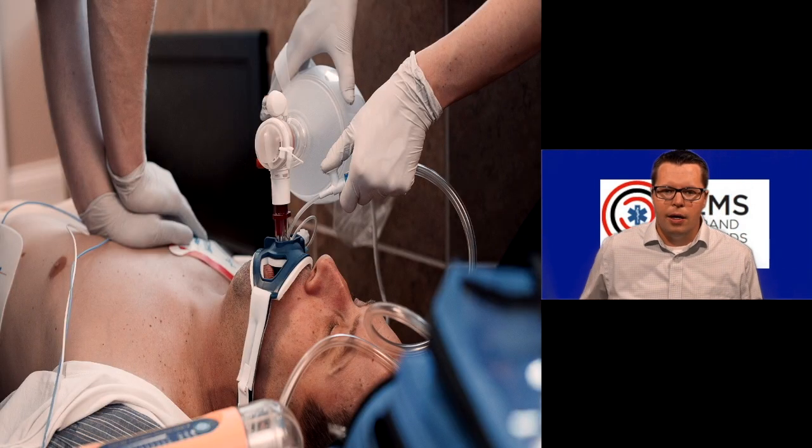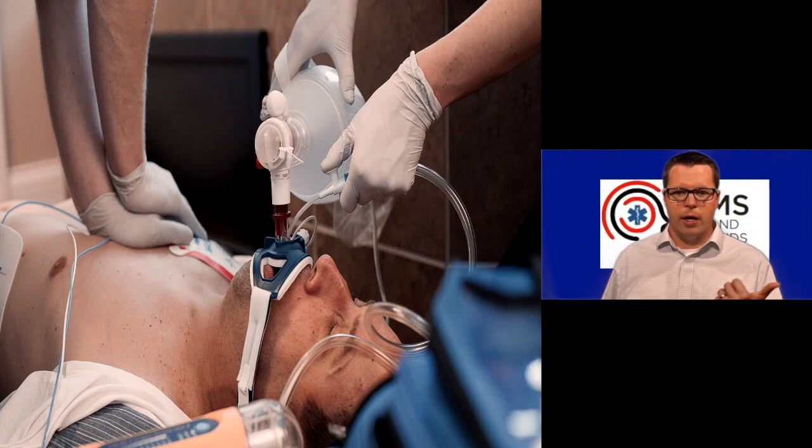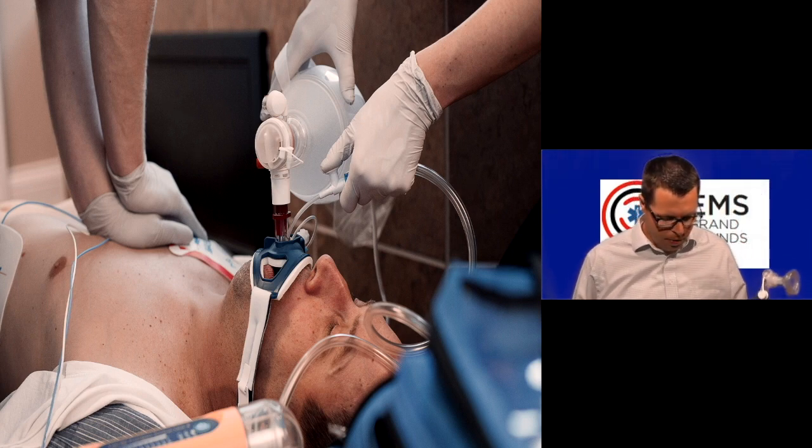So when you don't have a vent available, that mostly means you're probably going to have a bag, a BVM, attached to the end of your device. Maybe that's a mask, maybe that's a King Airway, maybe it's an ET tube. How do we make that perform the way we would want it to in terms of right tidal volume, not going over pressure, not exceeding a rate, et cetera? How do we do that? Well, it's important to look at the mechanics of the bag itself. I want to mention that real quick.